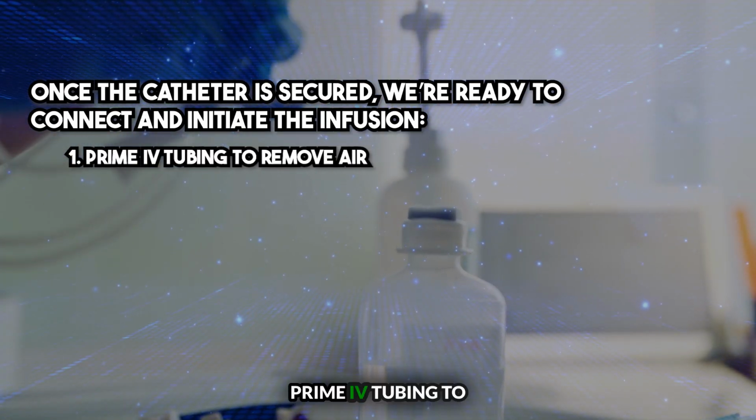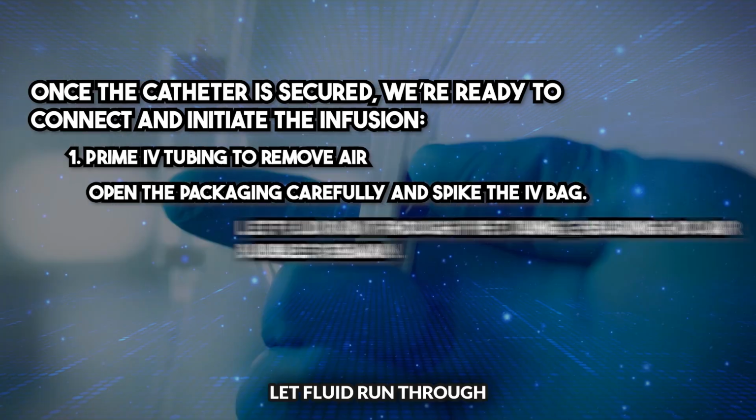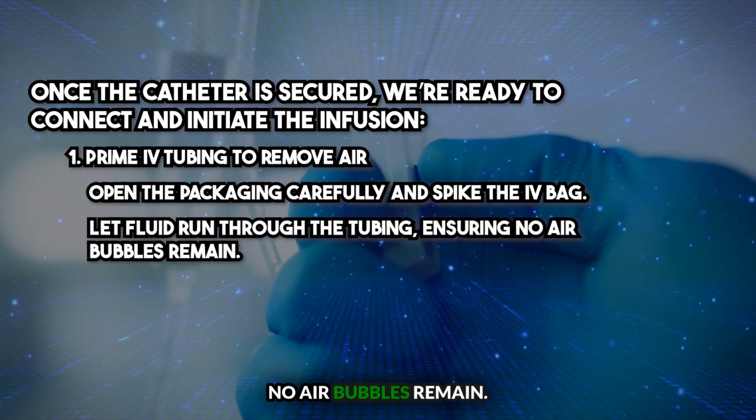1. Prime IV tubing to remove air. Open the packaging carefully and spike the IV bag. Let fluid run through the tubing, ensuring no air bubbles remain.